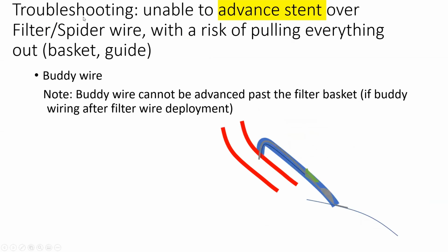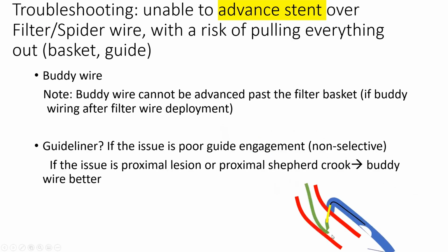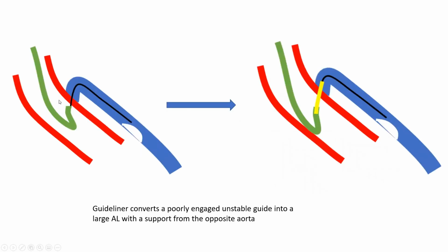Now, troubleshooting in another scenario: you've been able to deploy your Spider or filter, but you haven't been able to advance a stent over the filter wire, with a risk of pulling everything out. So what do you do? Advance a BMW wire. In this case, the BMW wire will not be able to be advanced past the basket. You're not going to be able to advance it past the proximal marker of the basket, but that can be enough to provide good support and grab of the guide. And you can use a GuideLiner, and GuideLiner converts a poorly engaged, unstable guide into a large AL with support from the opposite aorta.